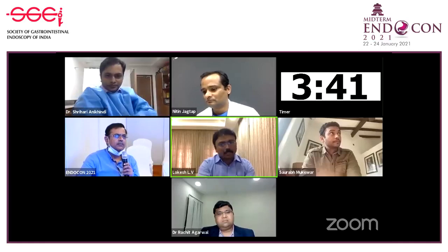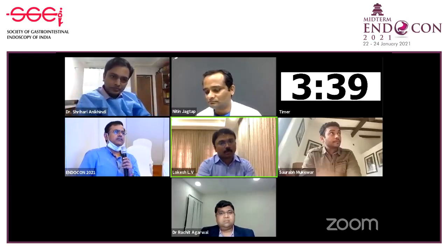Dr. Lokesh, would you prefer doing an endotherapy in patients who have non-erosive reflux disease? Because most of the findings have been that the appropriate patient would be those patients who are responding to PPIs and possibly patients who are having erosive esophagitis. So would you recommend endotherapy as an option for patients who have non-erosive reflux disease? When you see the NERD patient, most of them won't respond to the PPI as per the data.